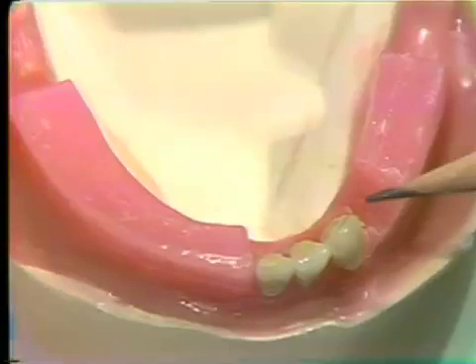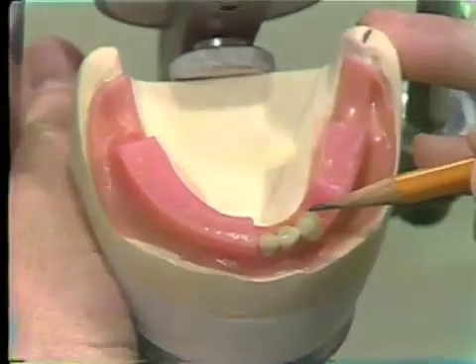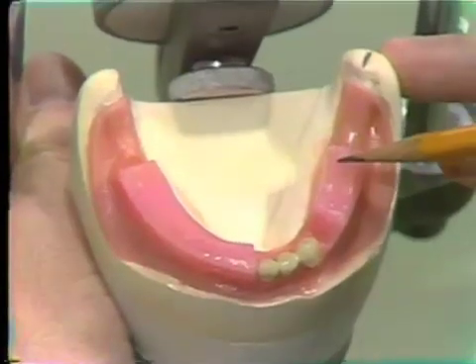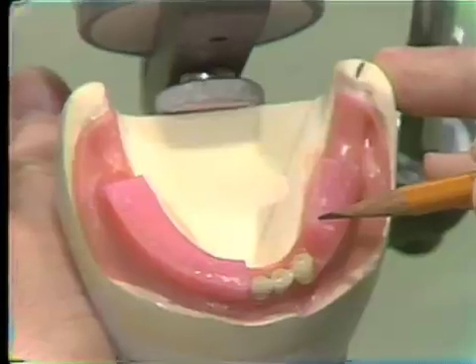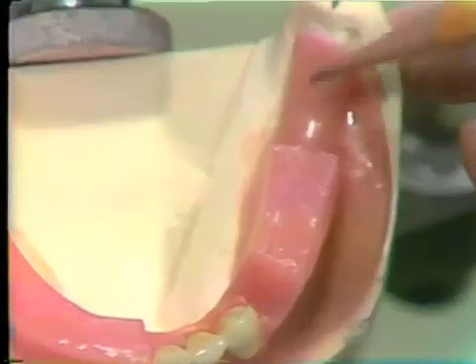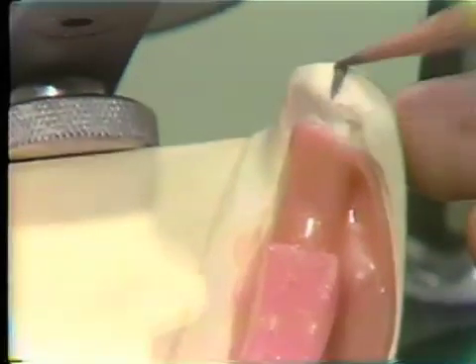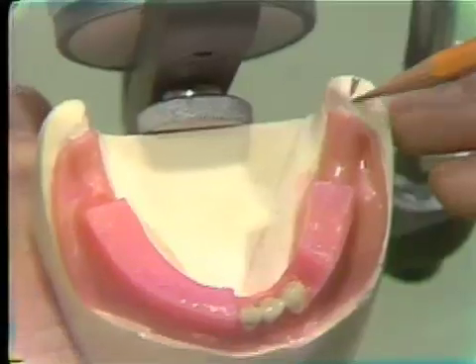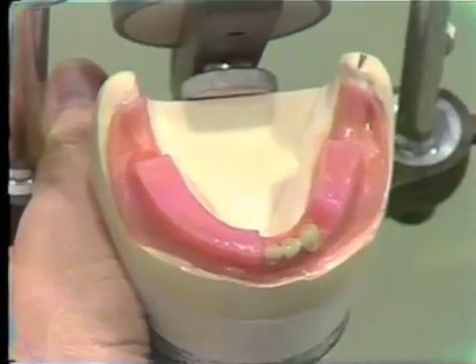And the cuspid, again, is twisted slightly so that this portion lines up with a line, and we can extend this right into the wax, make a groove in the wax that represents a line over the residual alveolar ridge, and that's aided by aligning it with the mark that we've made on the back of the cast. So that will be a starting point when we set the posterior teeth.